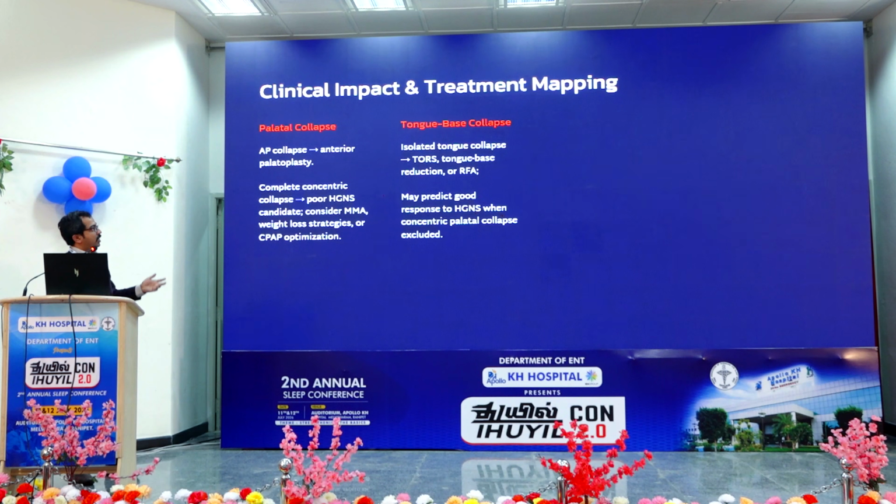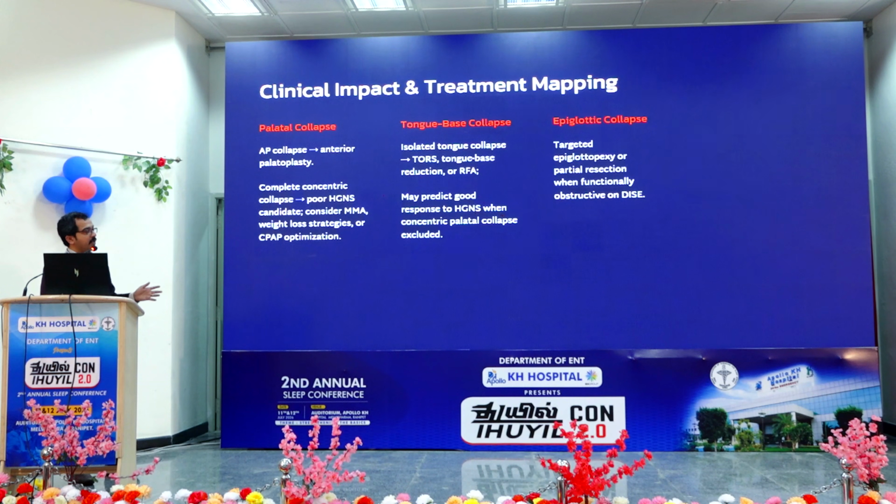Tongue base collapse: if you are seeing a collapse of the tongue base, this patient can be taken for a transoral reduction of the tongue base or a radiofrequency ablation. Epiglottic collapse, you can take for epiglottopexy or epiglottectomy.